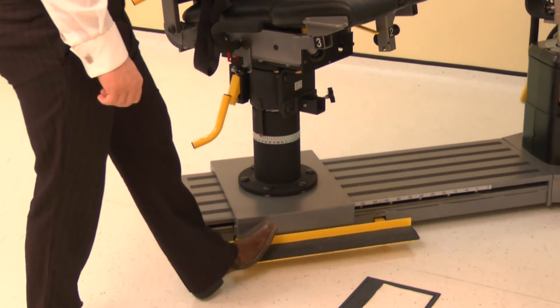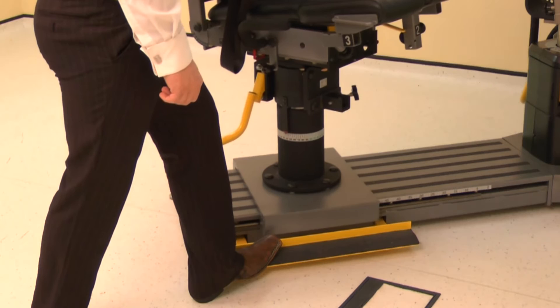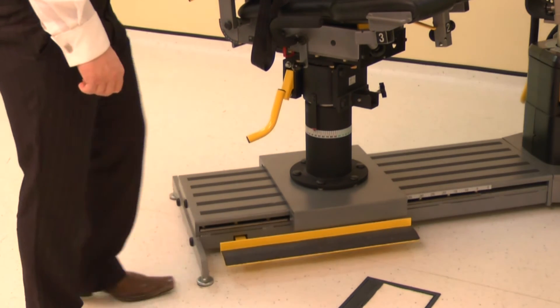Finally, position the monorail by pressing the kickboard and sliding the chair to position 59.